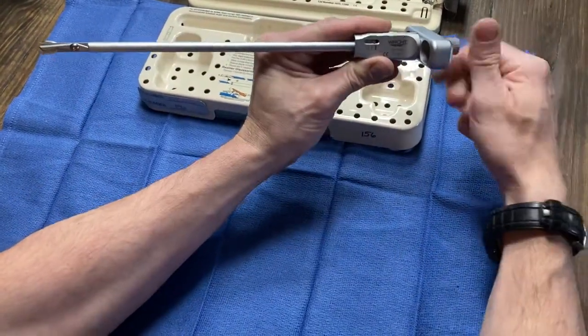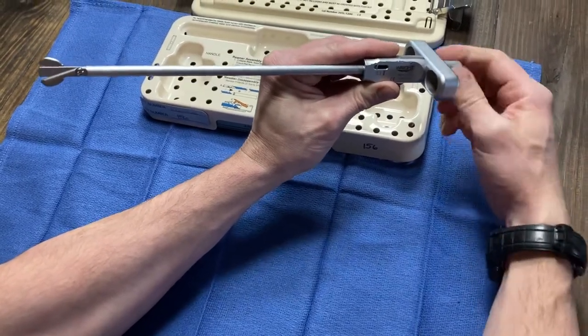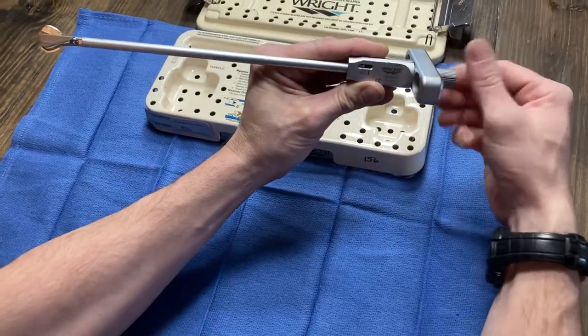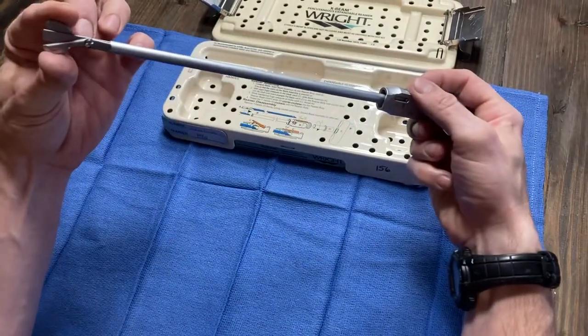You can watch down here on the blade. As I advance this from one to three, the blade will open. That expands — that's what it does inside the femoral head. Before you pull this out, you have to screw this back in all the way, and that will allow these blades to collapse.